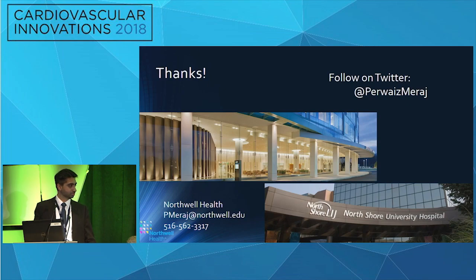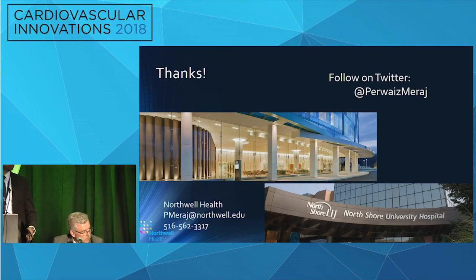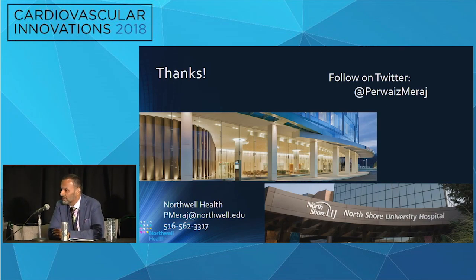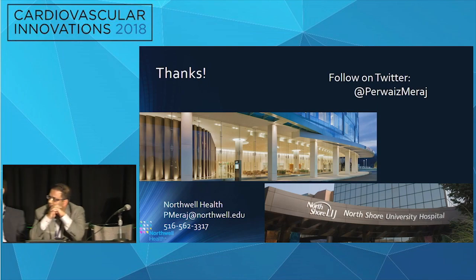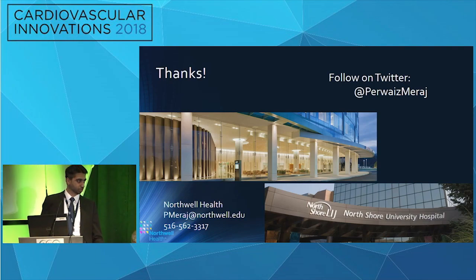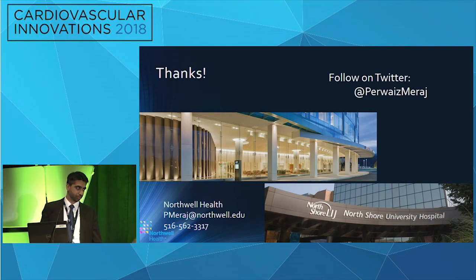There's one question there from the audience. Just a quick question. What about guide catheter extensions? If you have guide catheter engagement issues or extensive tortuosity, you want to extend your guide catheter beyond it. Do you prefer one device versus the other if you have a guide catheter extension in place? If you have a guide catheter extension in place, you're probably equally as likely to use a smaller rotational burr or an orbital atherectomy device.